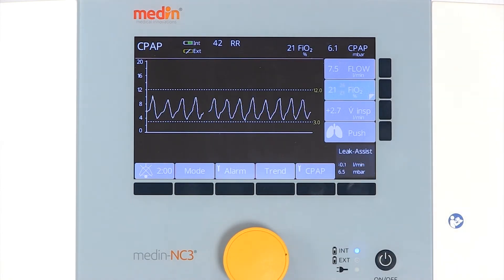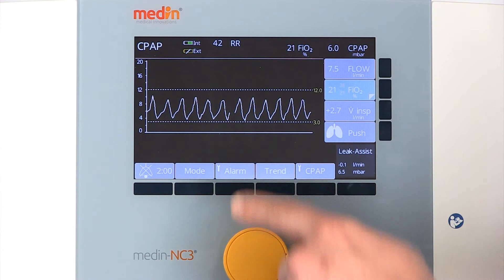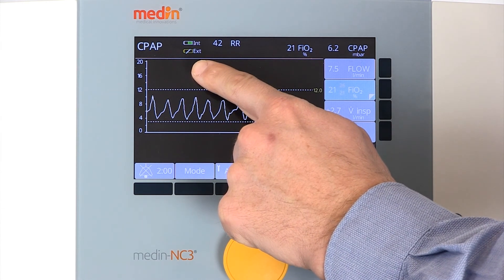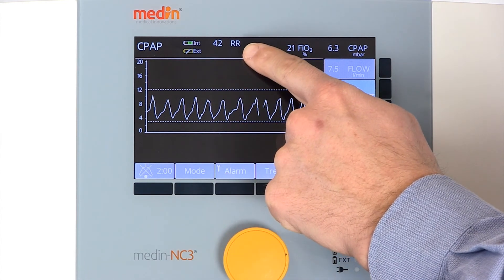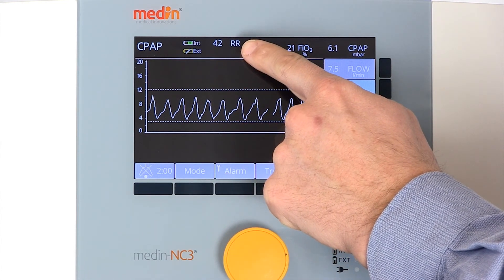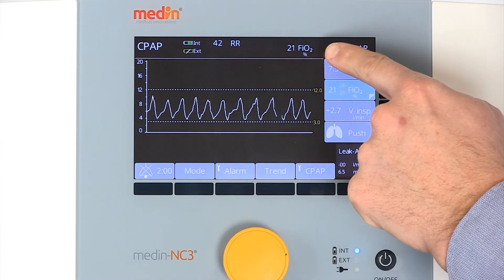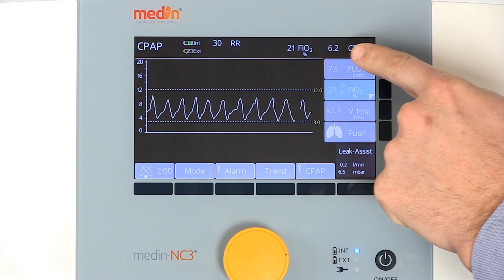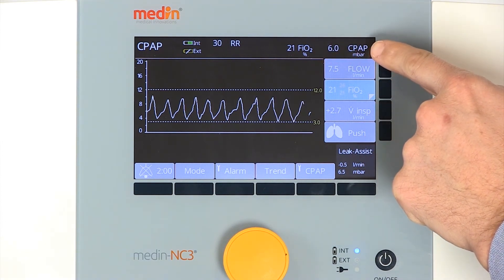The display also provides information about the battery status, respiratory rate, the FiO2 and CPAP pressure.